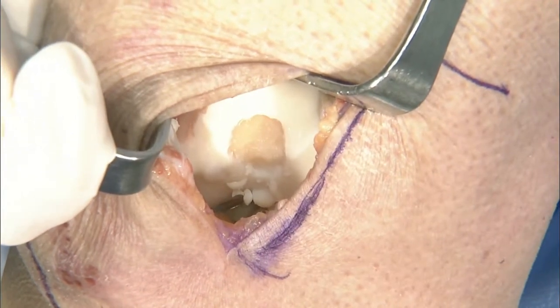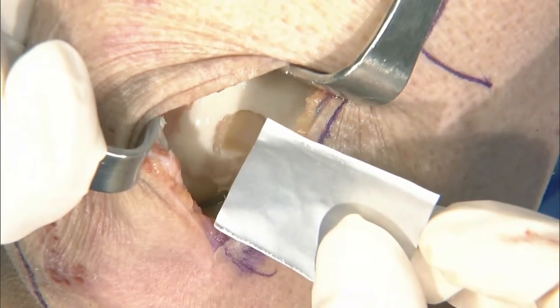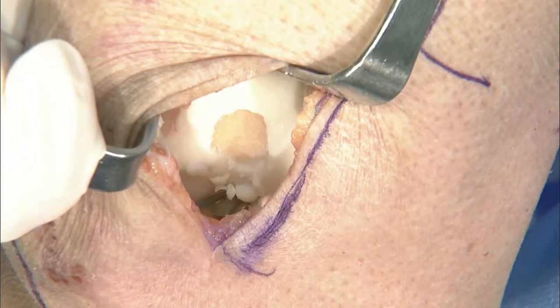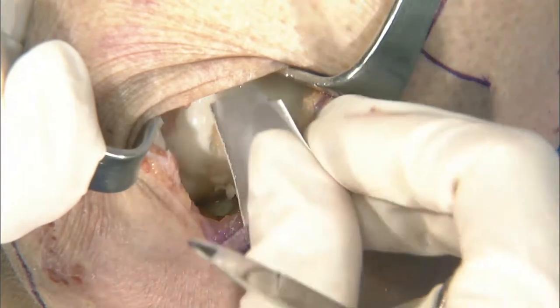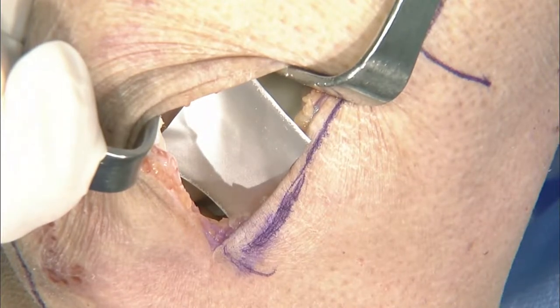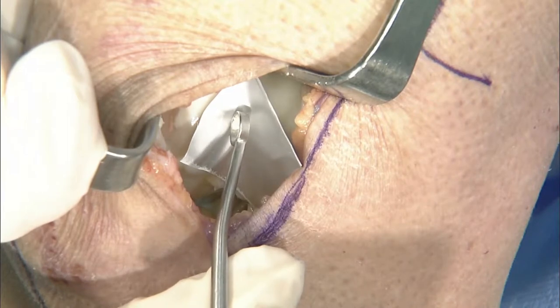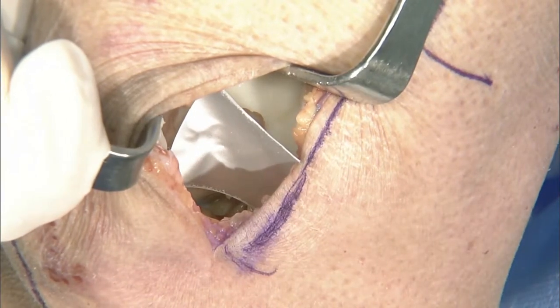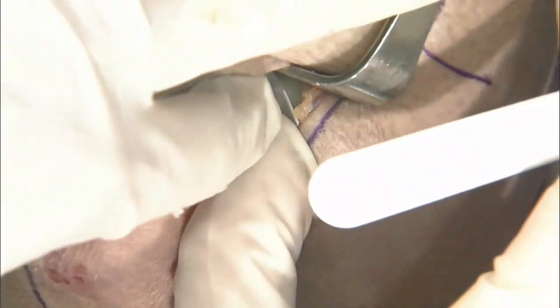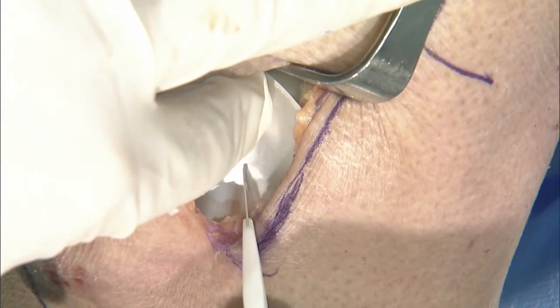And there's a couple different ways. I think that each person, in terms of how their mind works, is going to figure out what's easiest for them. But some of the things that you can do in order to size this is you can get it in here like this, and you can take a freer, something along those lines, to push out and get the idea where that's at. That's one way to do it. Another way is to take a knife right here and get it into that defect and then put around the sides of it where it's at.